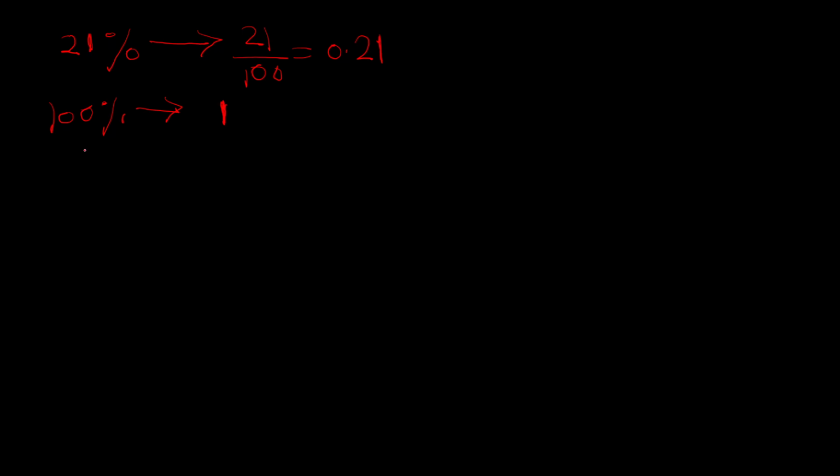So our aim is to reduce it to a safer level as early as possible, to an FiO2 of say 0.6 or 60%. How do we achieve this in ARDS or patients with other pathologies? We target and monitor SpO2, that is saturation on pulse oximeter, or you can be guided by the partial pressure of oxygen in millimeter of mercury in arterial blood gas analysis.